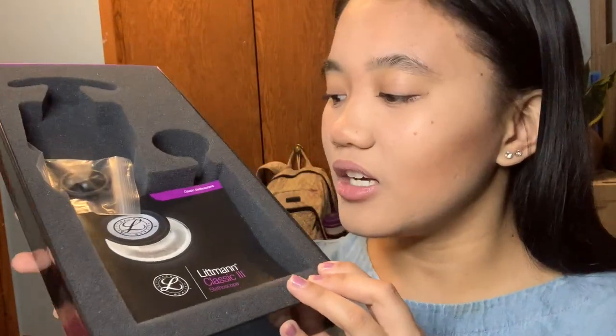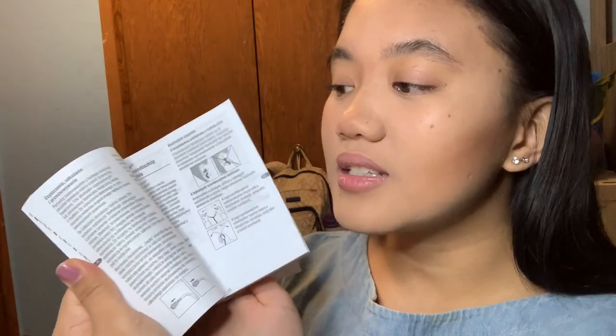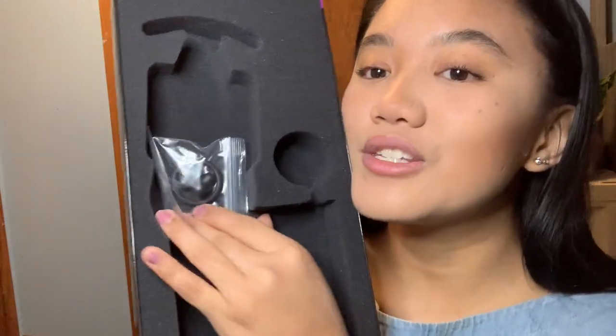In the box it also has your manual. If you guys actually read these, I will give you a million hugs because I don't. It also has this little Ziploc bag with extra ear pieces and an extra ring to put around your diaphragm and your bell.